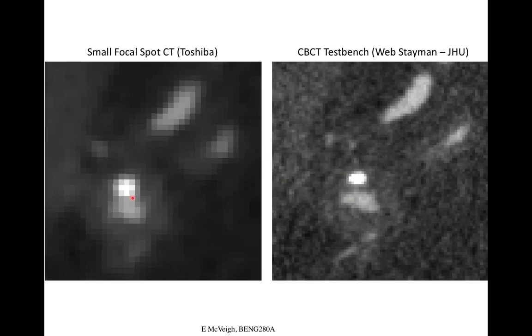Yeah? That's a great question. I'm going to repeat it because it won't get on the recording. The question is, in a clinical setting, if somebody's looking at a picture like this, are they not disturbed by all this high-frequency noise? And the short answer is yes, they are. Depending on the task, they can cope with the noise or not. But most humans, when they're hunting around looking for something, like to see smoother data than this.